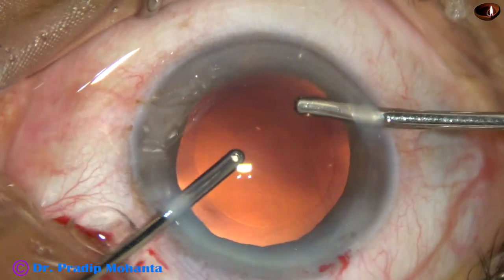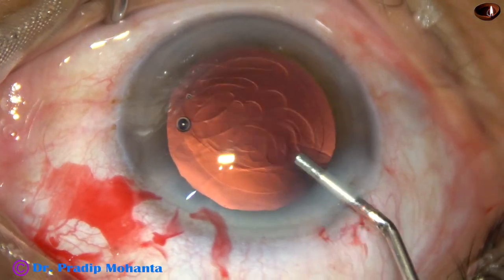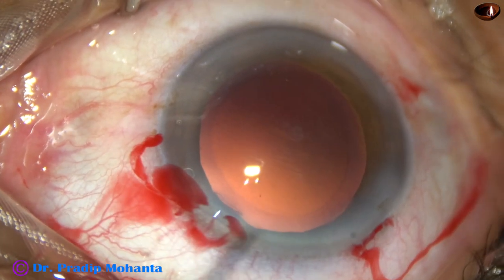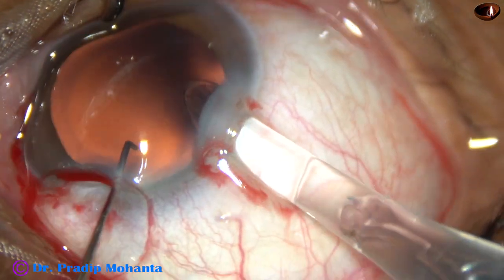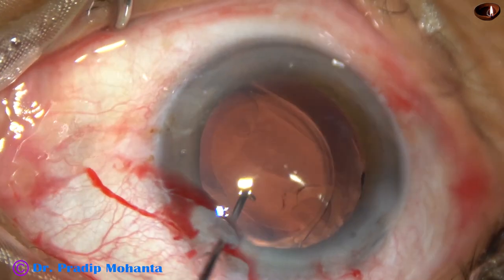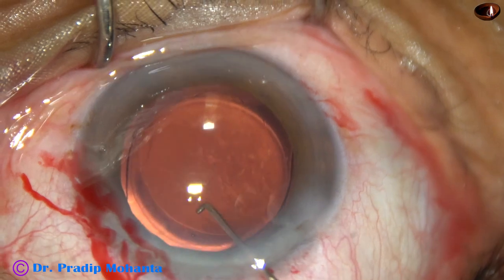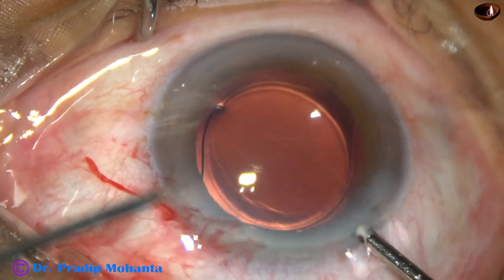In this case, viscoelastic has been used to fill out the capsular bag for implantation of the intraocular lens. This is 2% HPMC and now a single-piece monofocal intraocular lens is being implanted in the capsular bag. Simcoe has been used for removal of a portion of the viscoelastic and then bimanual irrigation aspiration is being used.